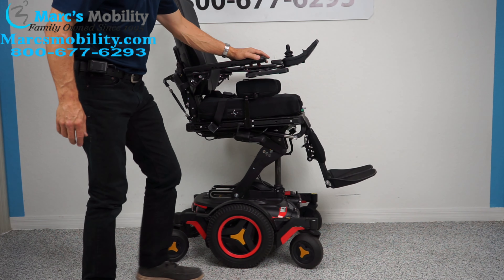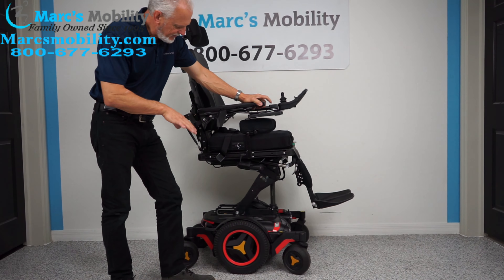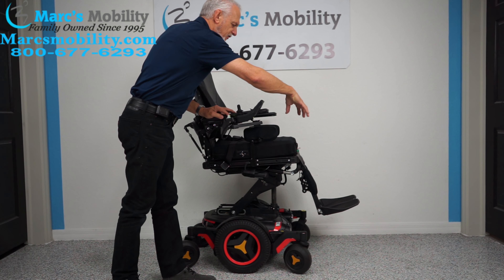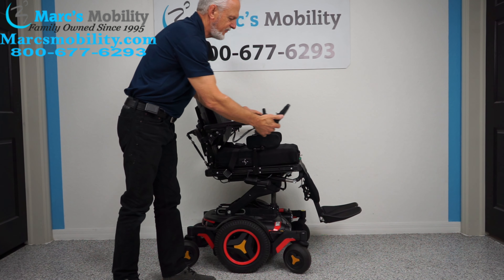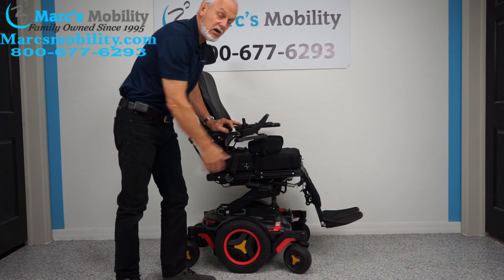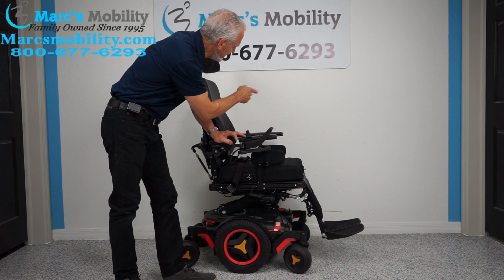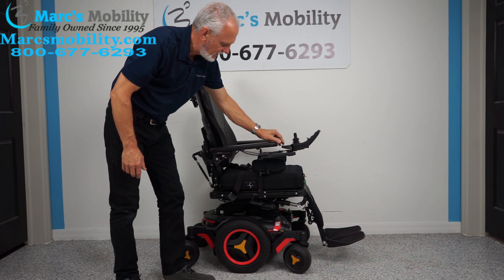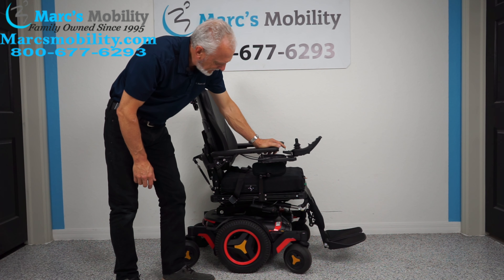Now I'm bringing the seat back down. While the seat goes down, notice the swing-away joystick — it frees up about 10 inches from the front, allowing you to get much closer to a dining table. If you're left-handed, we can put the joystick on the left side and it'll swing to the left.